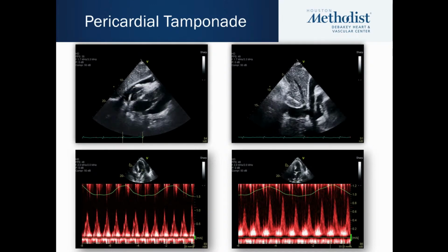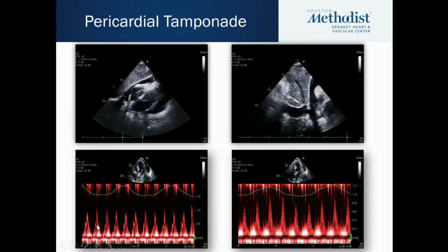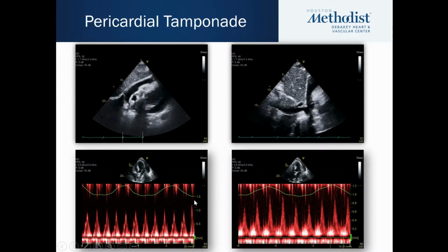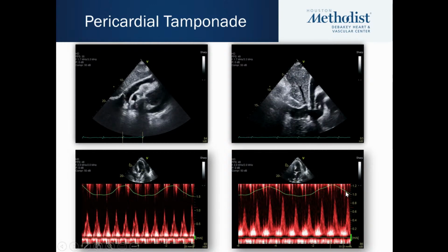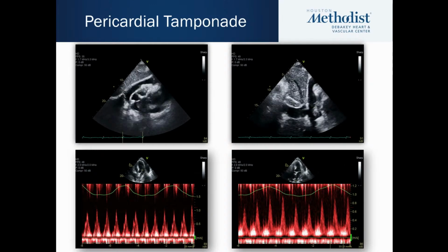So one thing to notice here when you do your mitral inflow is the E to A ratio. Notice how you have lower E waves and taller A waves. And there's minor variation, but no significant variation across the velocities. When you look at the pulmonary veins, notice that there's a significant amount of variation here. And that gets into that previous slide where we show that the pulmonary vein Doppler or flows may not necessarily be still concordant with what happens on the mitral valve.